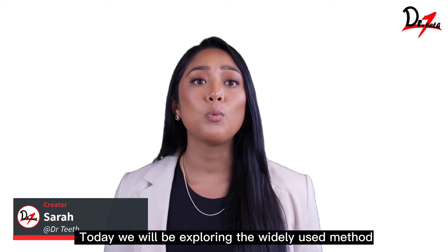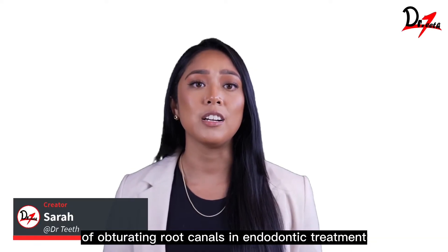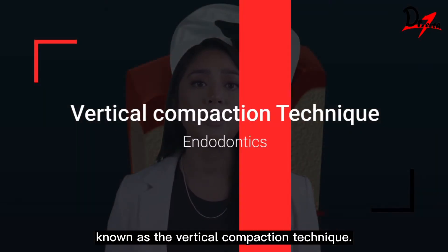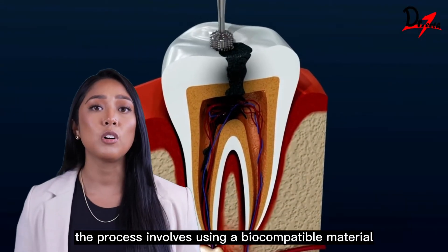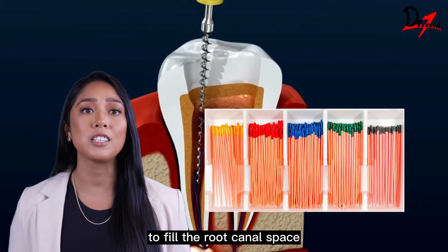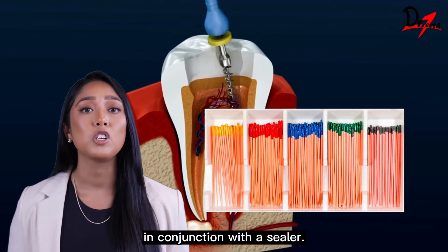Today, we will be exploring the widely used method of obturating root canals in endodontic treatment known as the vertical compaction technique. The process involves using a biocompatible material called heated gutta percha to fill the root canal space in conjunction with a sealer.